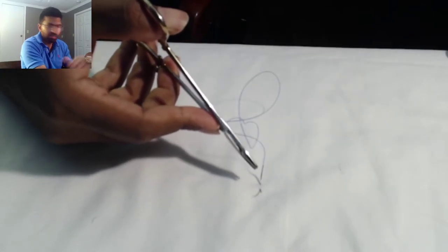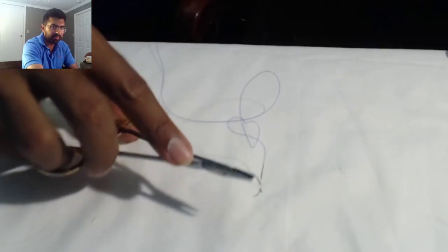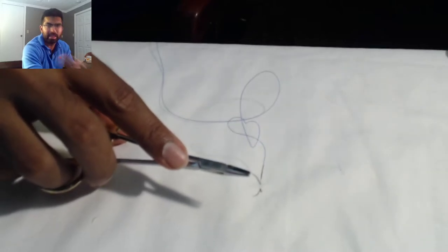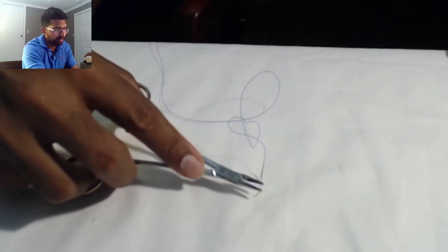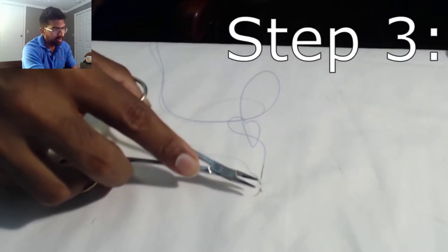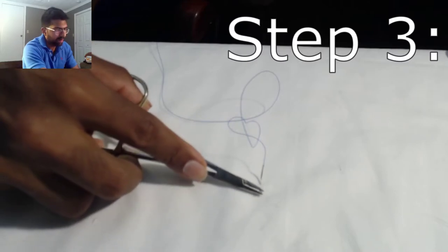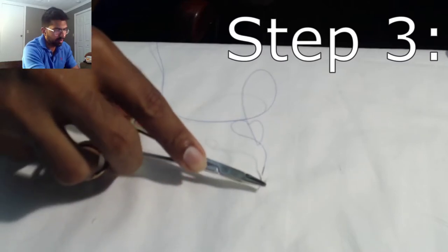Once the suture is in, watch my hand now, we're going to pronate, and this will now, you'll feel the relaxation in your grip. With this, there's several ways to approach this, but the way I always prefer is moving the needle from the front end. So I'm actually going to supinate a little bit, grab the front of the needle, and pronate even more.